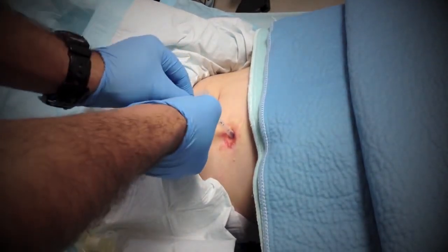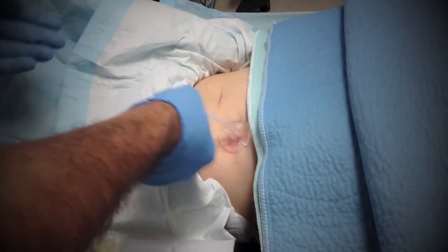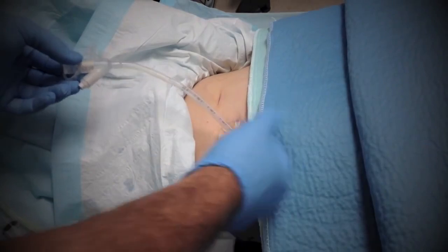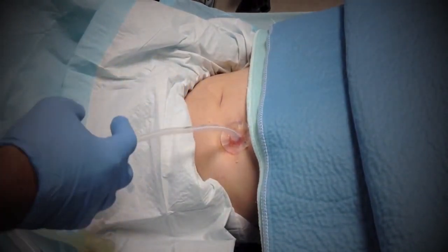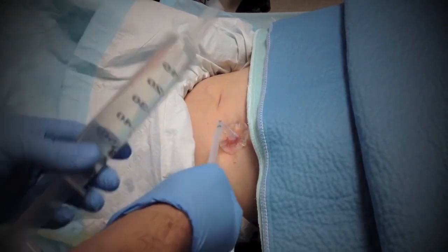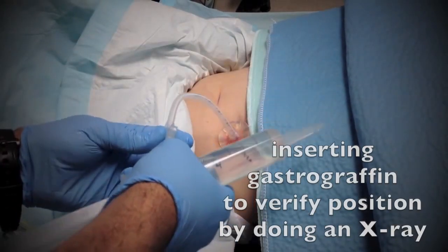Okay. And now we pull this in so that the hole doesn't get too large. And now it doesn't move. It's in place. Now we're going to have the X-ray people come in and do the gastrografin. So this is just fluid with gastrografin. It's a radiodense material for when we do the X-ray.